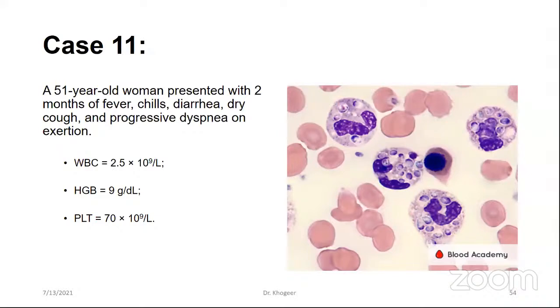Is there any effect of steroid drugs on the white blood cells? Usually steroids increase the neutrophils, but morphology-wise it may show some little changes, not at the level of true dysplasia.